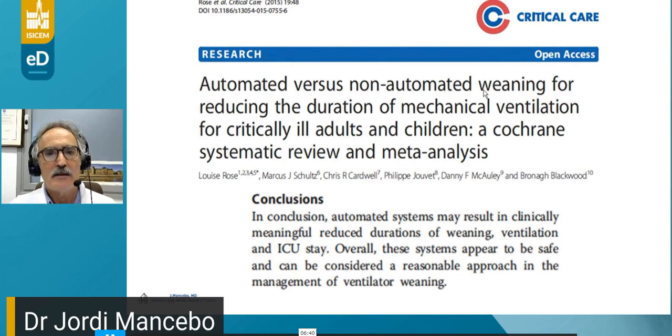These automated systems to wean patients from mechanical ventilation, in general, result in a significant reduction in the weaning duration, in the duration of mechanical ventilation, and also in ICU stays.